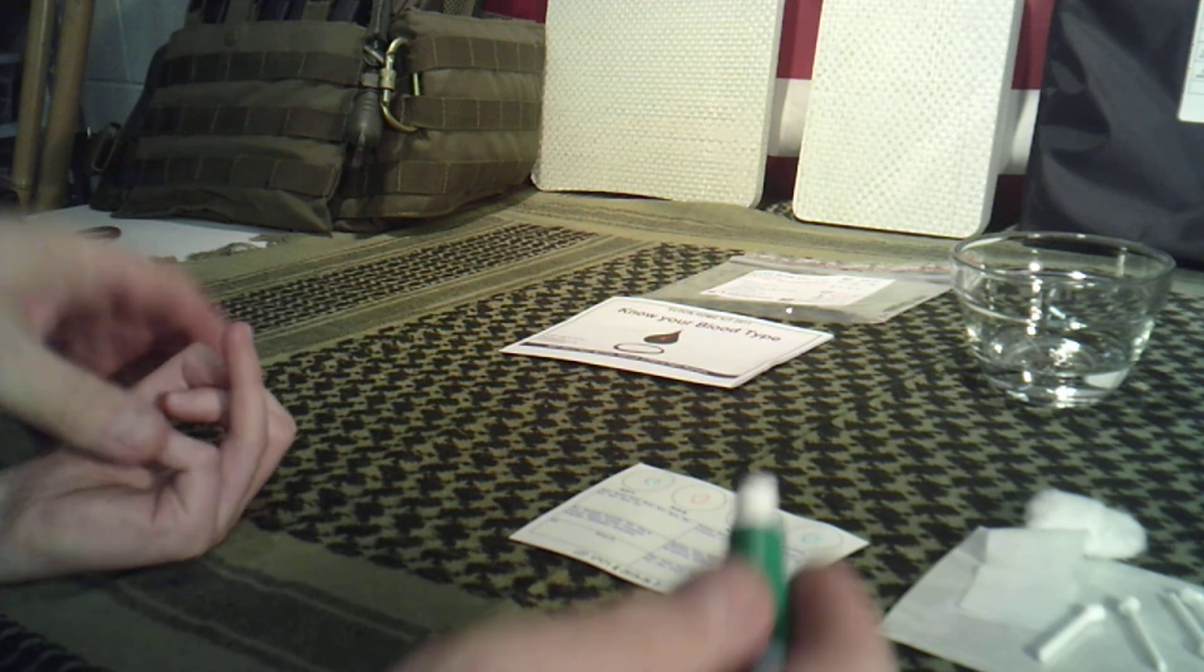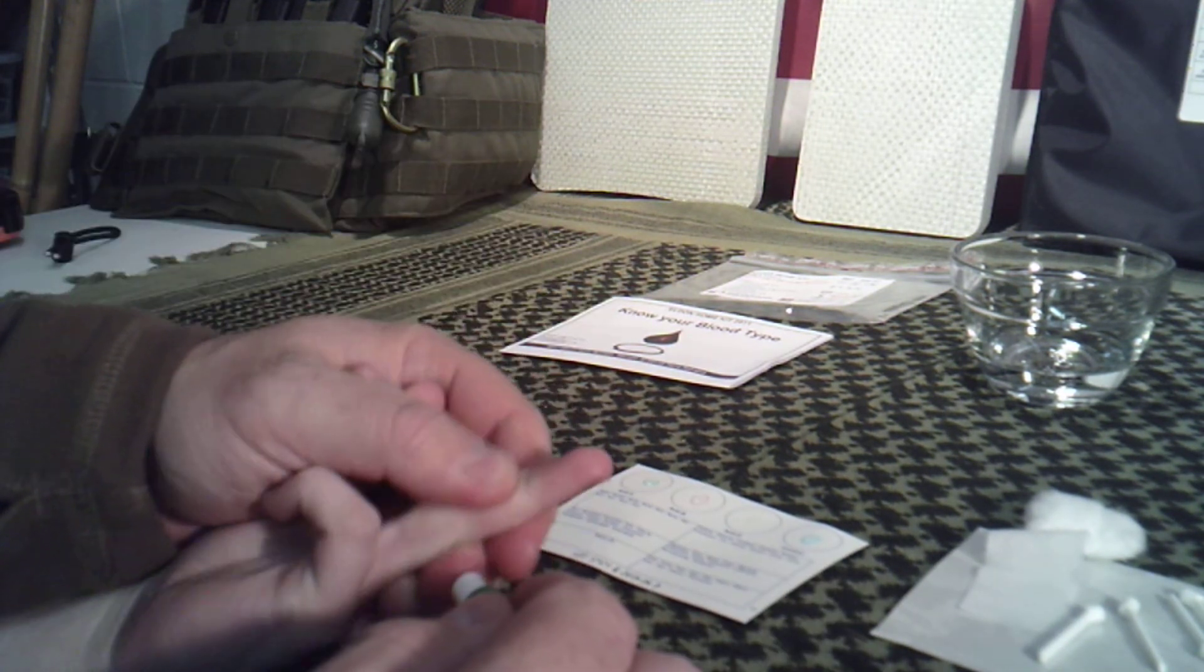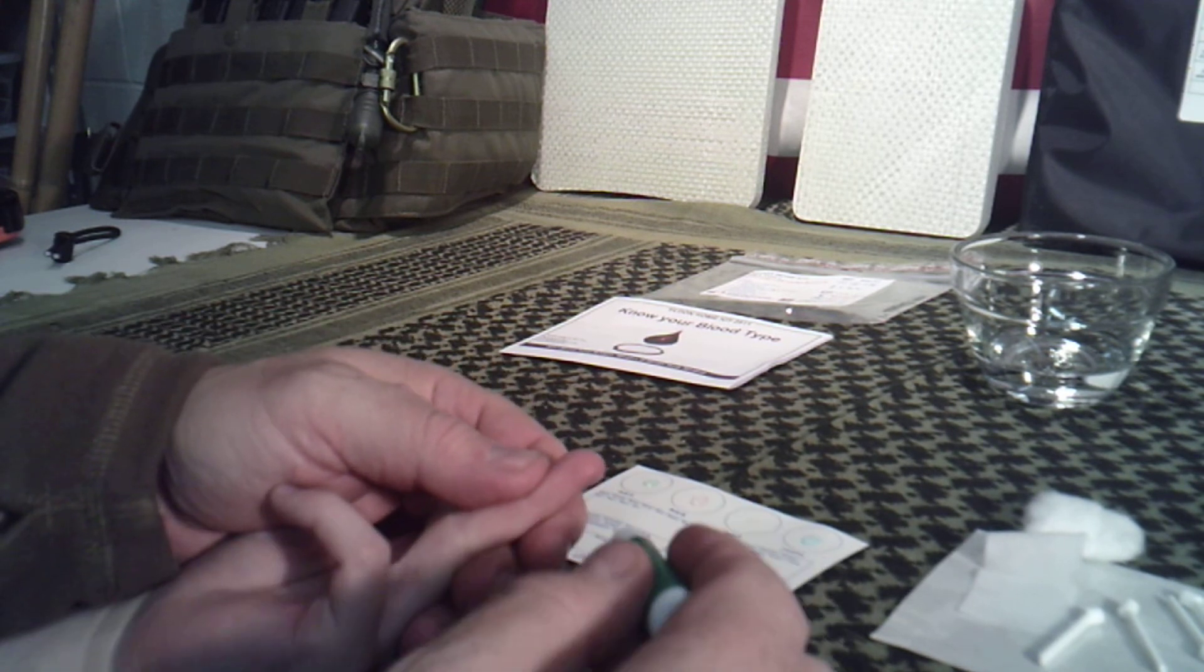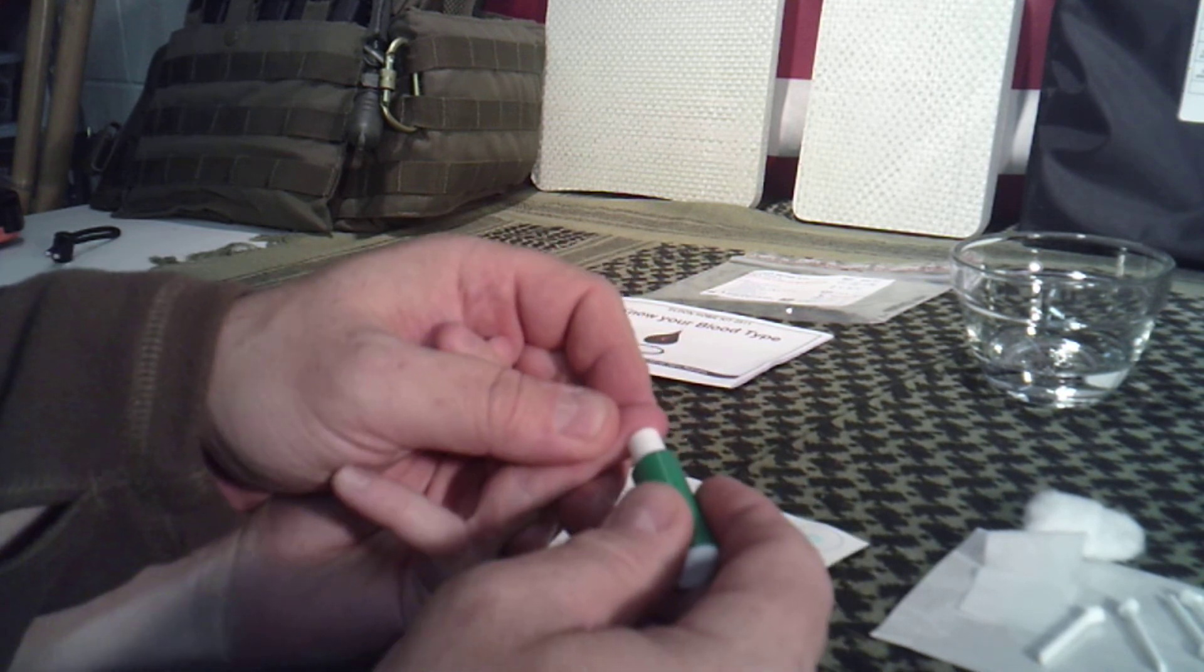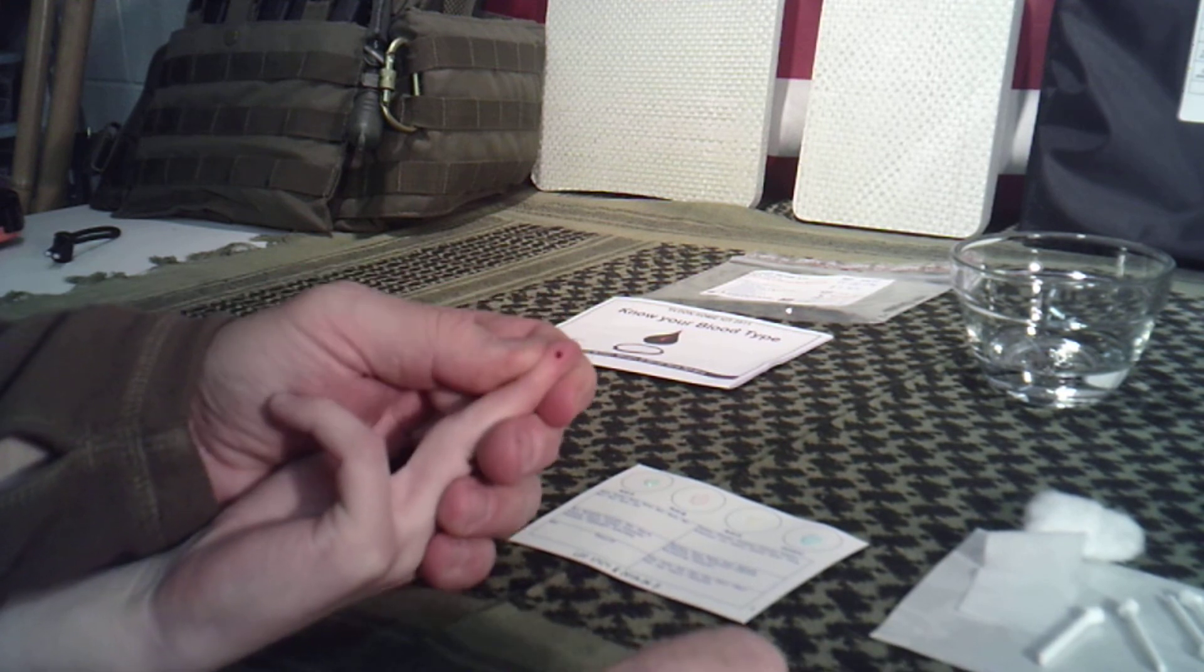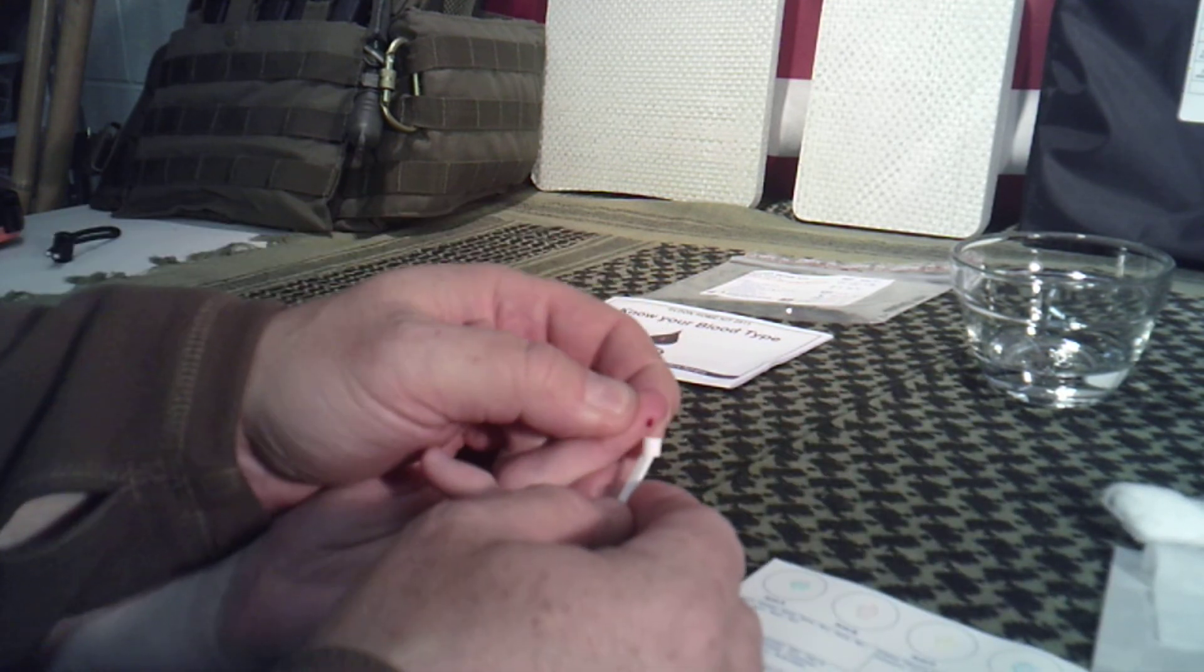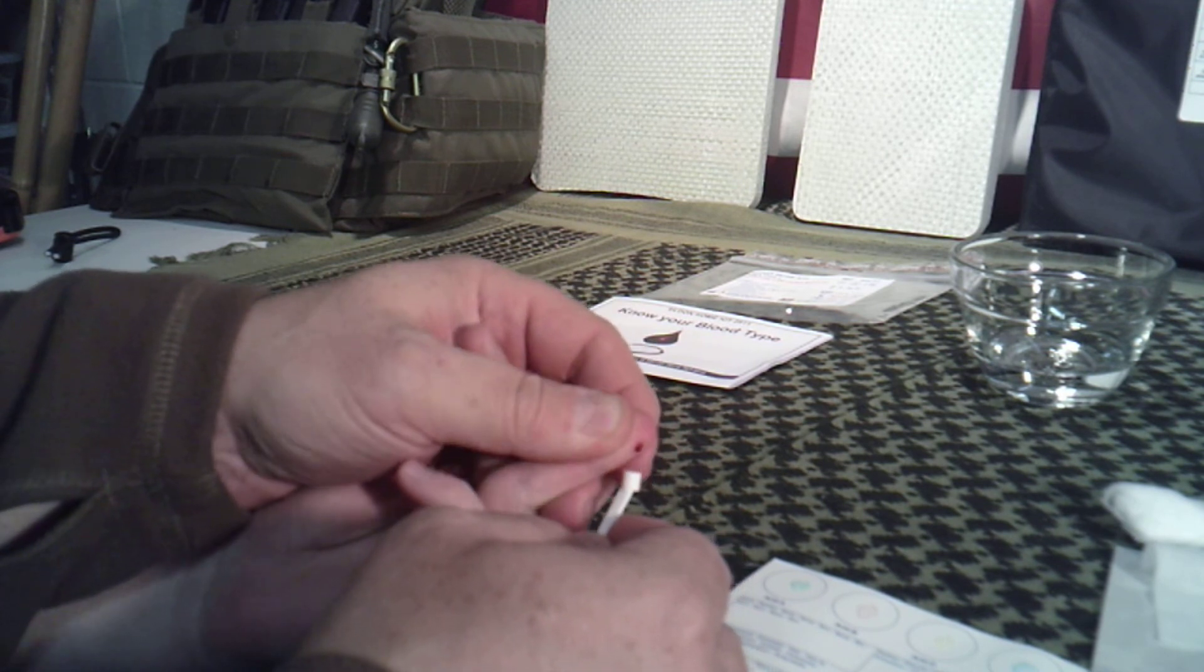Alright, then you take your lancet like this. You go ahead and massage the finger, and before the person starts, you can have them hold their finger or their hand down by their side. It'll start pushing that blood down. Just along this edge here, you'll take the lancet like this and just pop it. Just like that, you'll start seeing the blood come out. What we're going to do, I'm going to try getting all this on camera for you. You're going to take one of these.